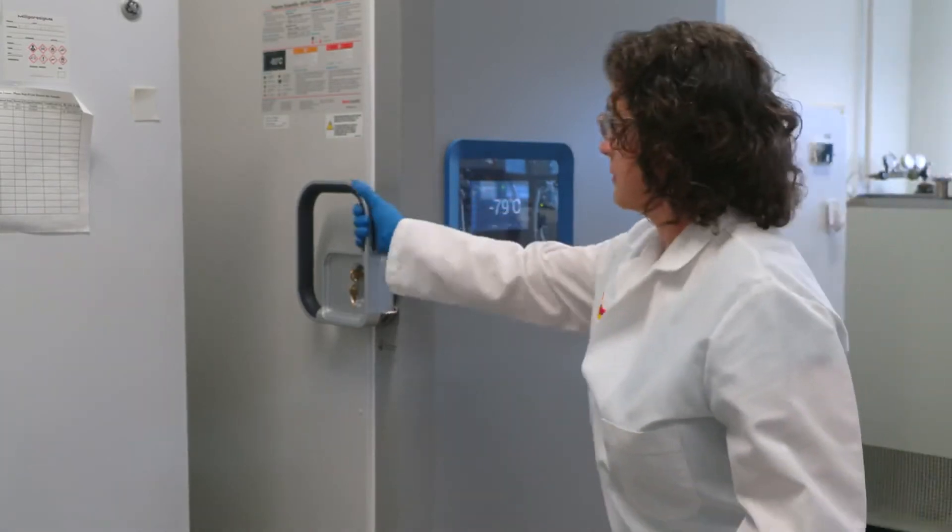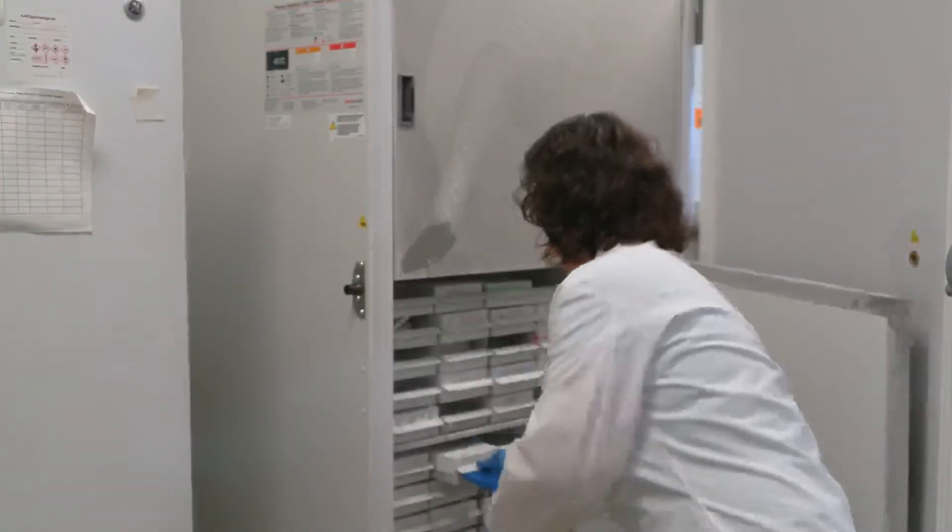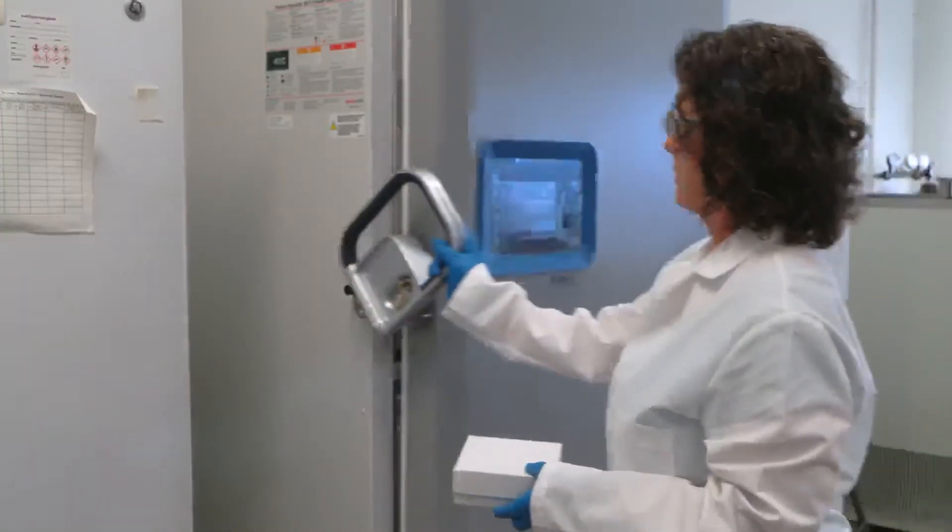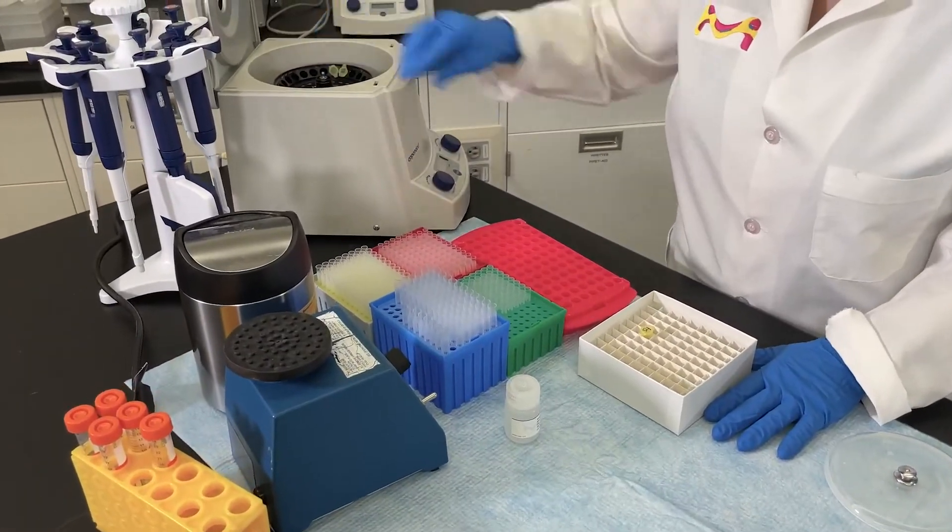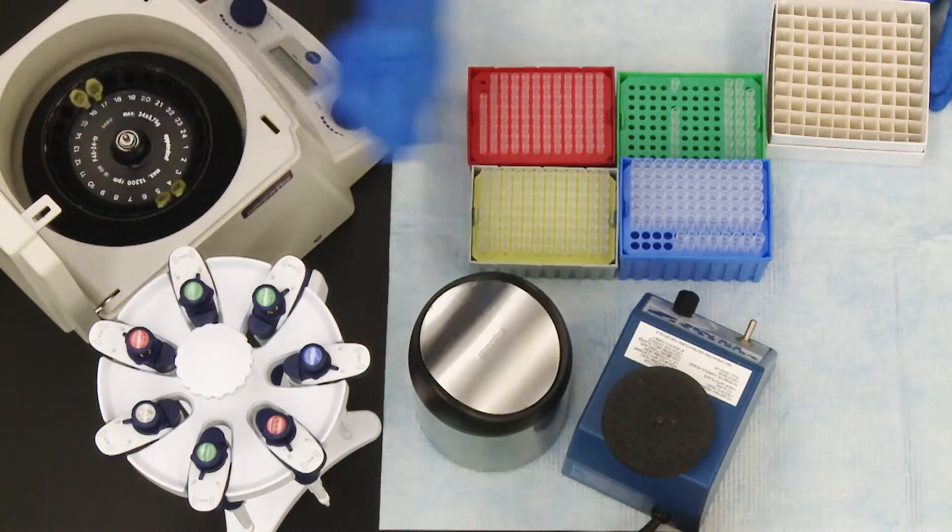After serum or plasma samples are separated, they can be assayed immediately or the samples can be aliquoted and stored at minus 20 to minus 80 degrees Celsius. Vortexing after thawing is recommended for a homogenous sample followed by centrifugation to reduce the possibility of bead aggregation.